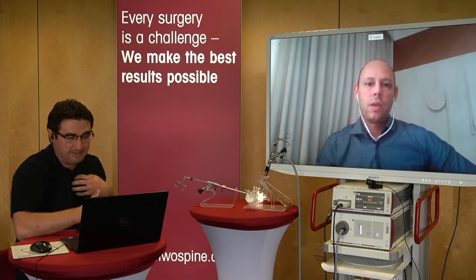When we have some experience, you can use the transforaminal approach and the interlaminar approach and the cervical one. But it is not perfect for this.